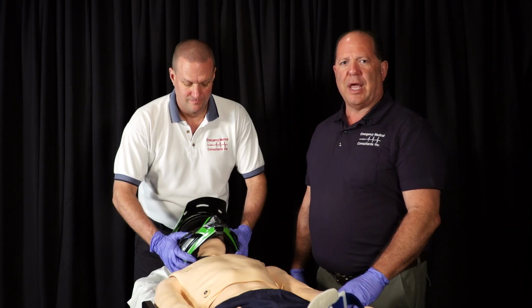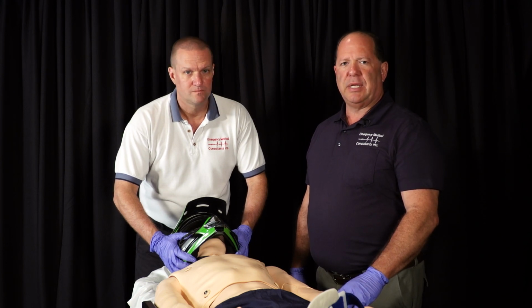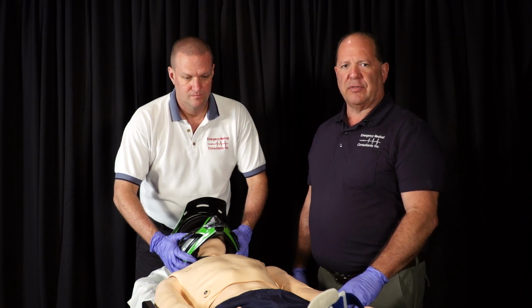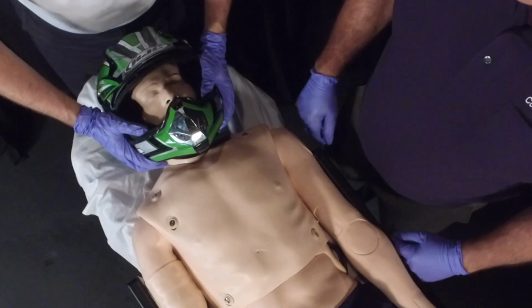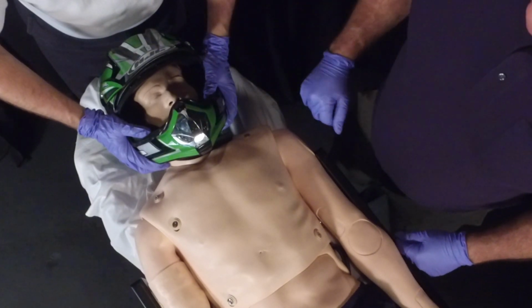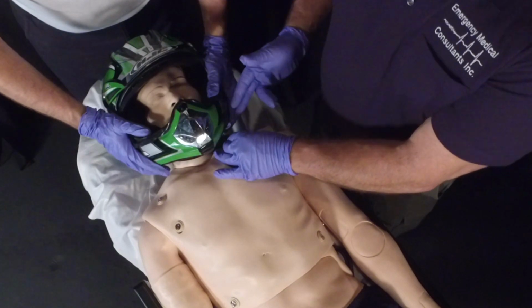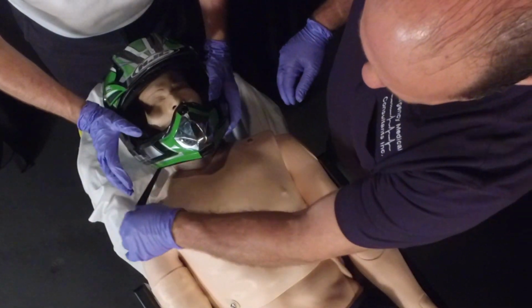In this section, we'll look at removing the helmet briefly. The speed at which this needs to be done really is based on the stability of your patient's, that is, his airway and his level of consciousness. So the first person should be evaluating that as well as holding the C-spine neutral by holding onto the helmet. The second rescuer would remove the helmet strap. If this was urgent or critical, I may choose to rapidly cut the strap.